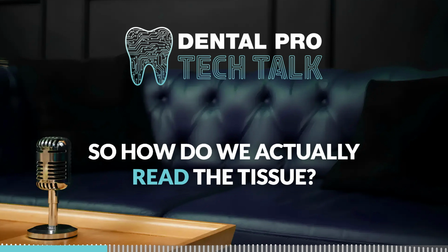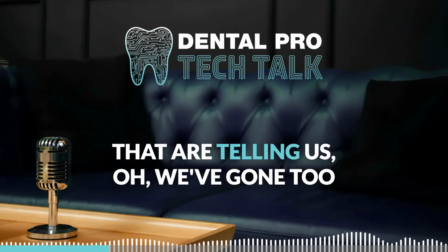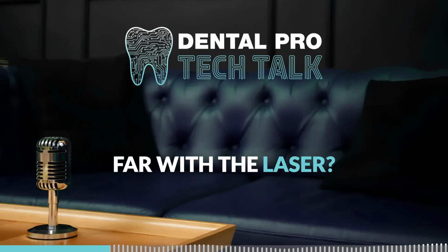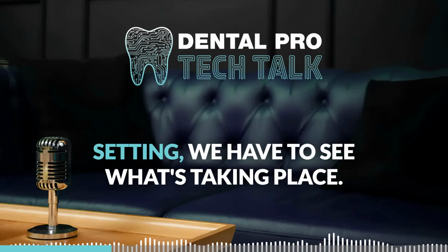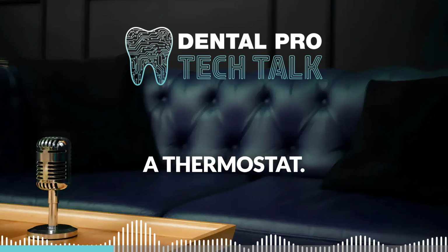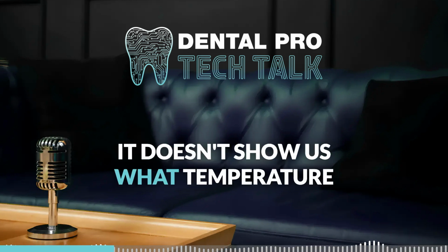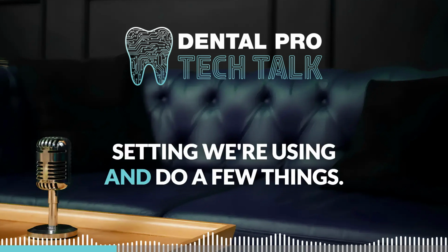So how do we actually read the tissue? What are those visual cues that are telling us, oh, we've gone too far with the laser? To read the tissue, when we put it at a setting, we have to see what's taking place. So remember, our laser doesn't have a thermostat. It doesn't show us what temperature we're reaching. The tissue will heat up according to the setting we're using and do a few things.